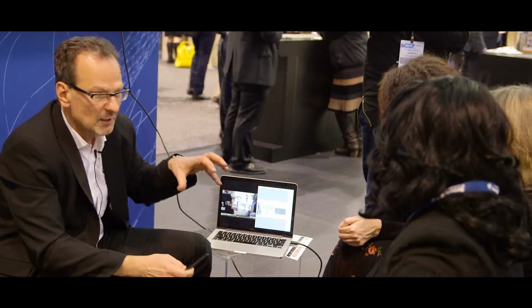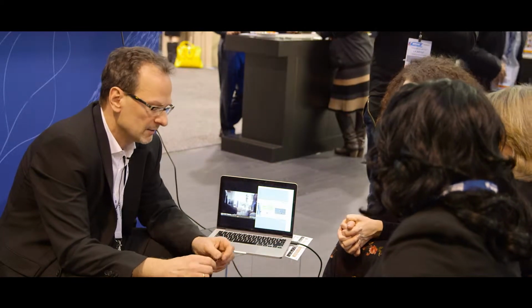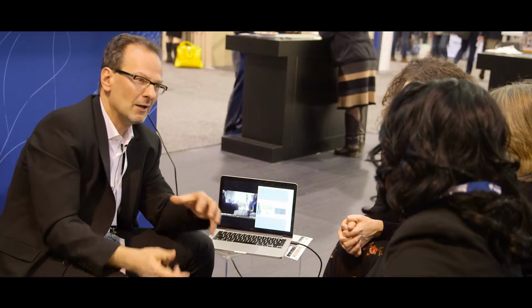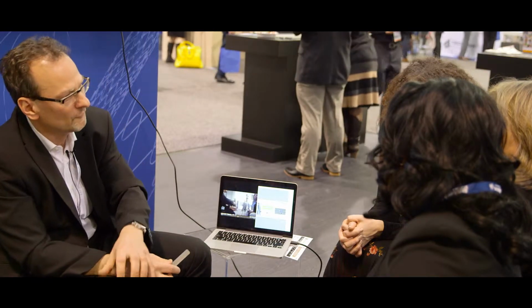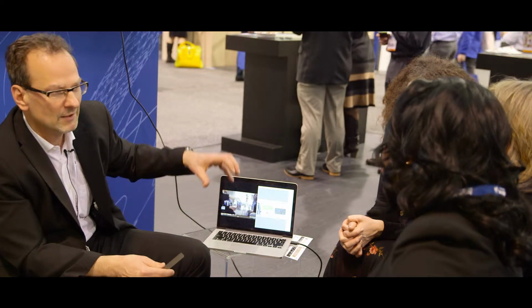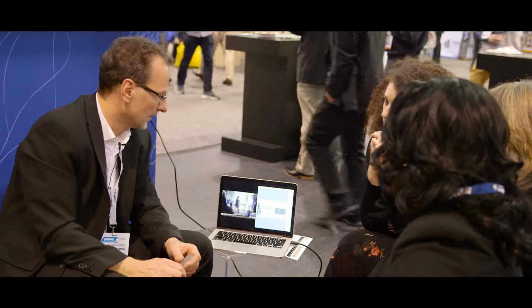So in those inclusions, did you work with fatigue before? Okay. Fatigue is a very complex, let's say, surrounding. You have a lot of influences. If your part is designed wrong, you see fatigue. If the application is used unlabeled, or off-label, it could create fatigue, because it was designed for a different purpose and somebody used it for something else. Surface defects could create fatigue. In this special case, inclusions, so particles in the material, could create fatigue.